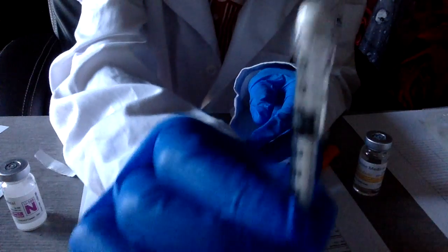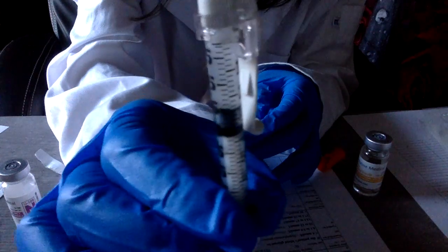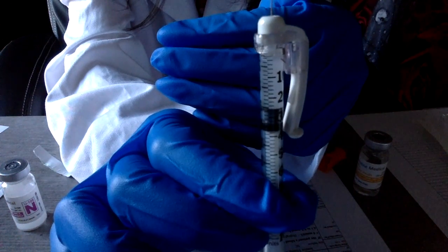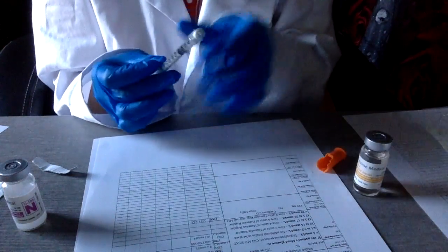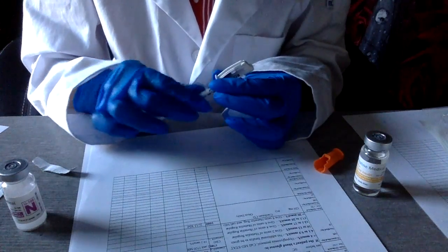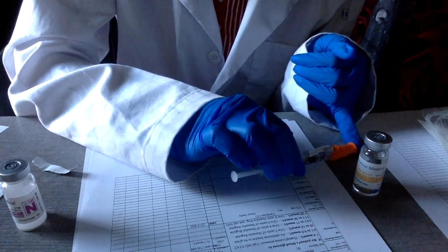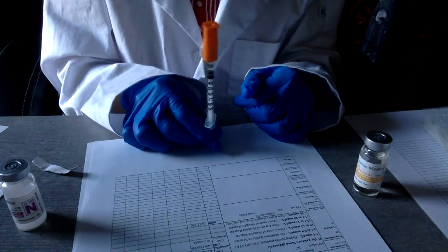And that would be the end of the mixing of the insulin. And if we're not at the bedside, you would just scoop up the needle into the cap. Alright, and then you'd be ready to go when you reach the bedside.